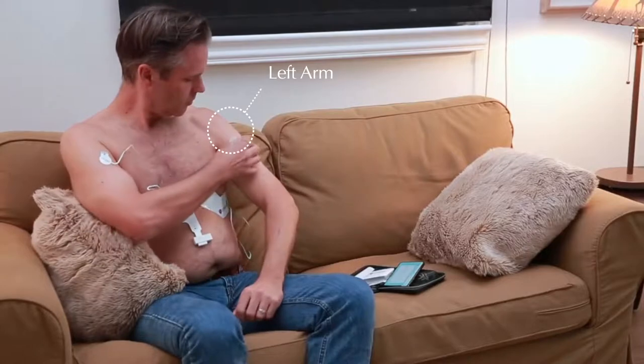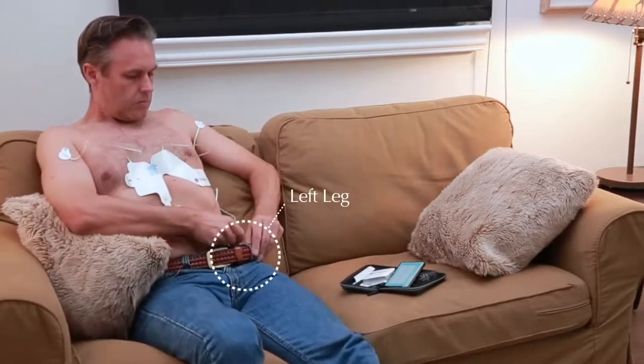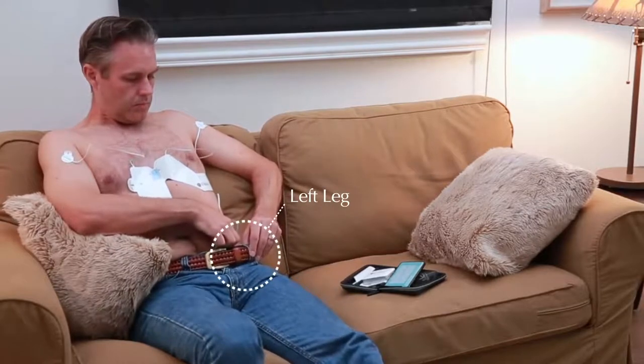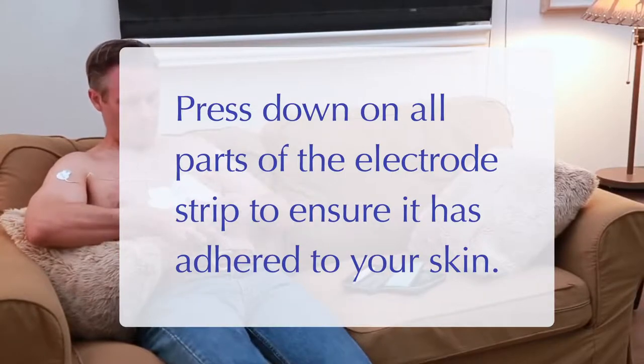Place the lead marked left arm to the left arm, and the lead marked left leg to the lower abdomen or upper thigh. Press down on all parts of the electrode strip to ensure it has adhered to your skin.